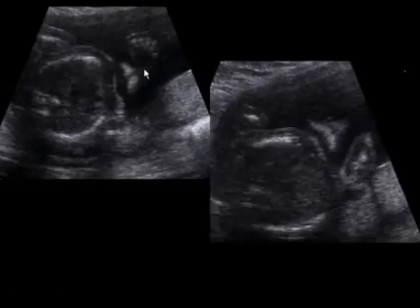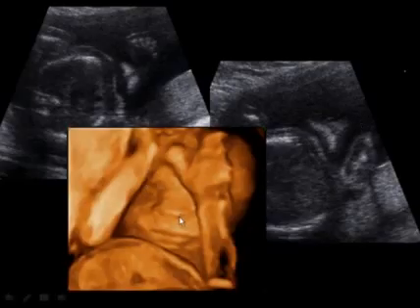But if we scan a little bit more posteriorly, we can see that actually the lip is completely intact when I have the nose on the image, and this is just a prominent philtrum or that cleft in the soft tissue in the upper lip. And it can be confirmed, if possible, with 3D imaging. Here's an image of the fetal face, and we can see that the upper lip is completely intact.